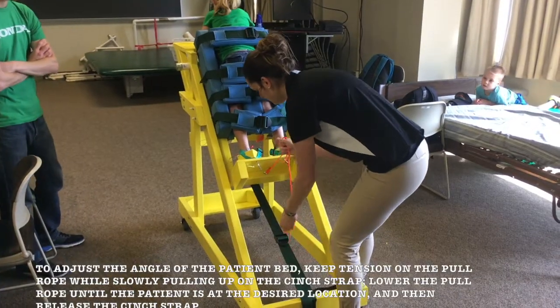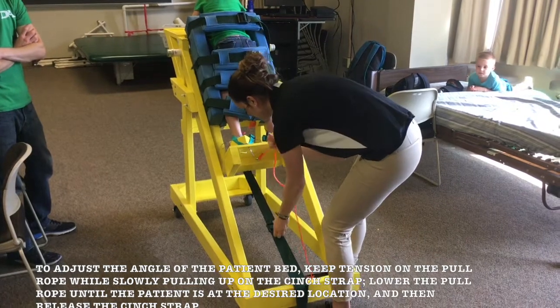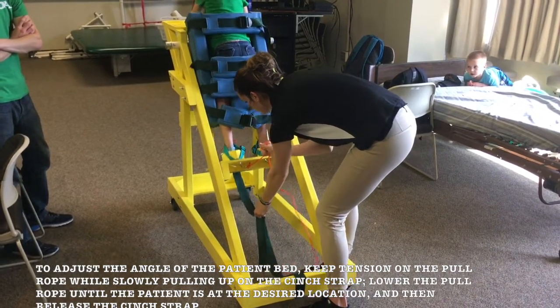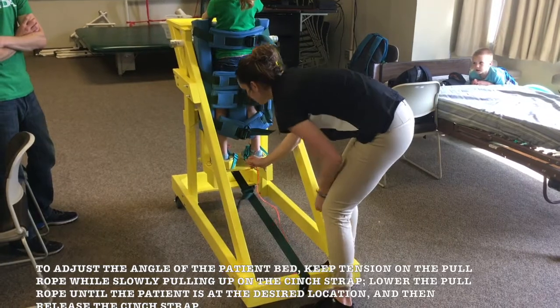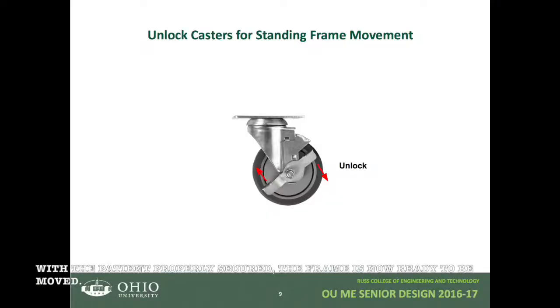To adjust the angle of the patient bed, keep tension on the pull rope while slowly pulling up on the cinch strap. Lower the pull rope until the patient is at the desired location and then release the cinch strap. With the patient properly secured, the frame is now ready to be moved.